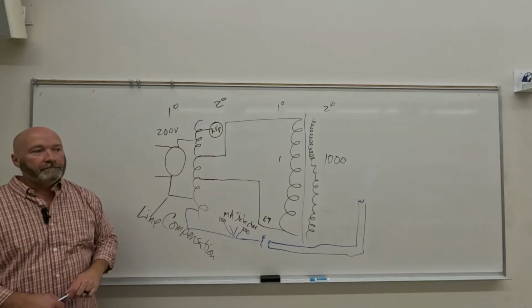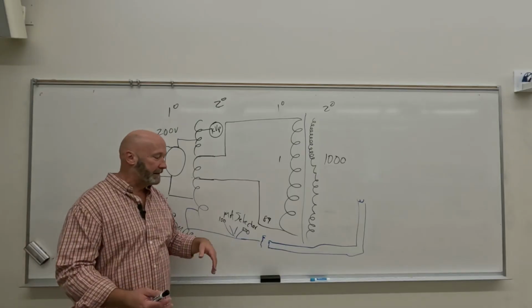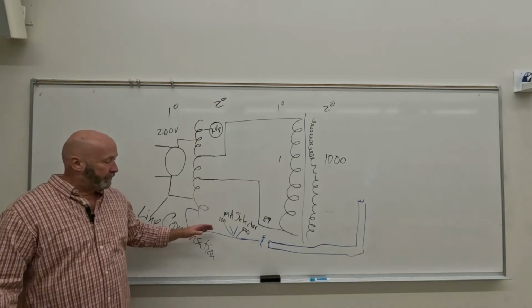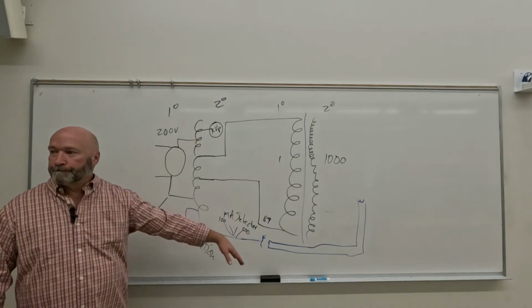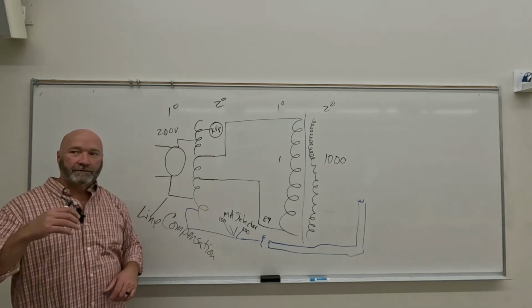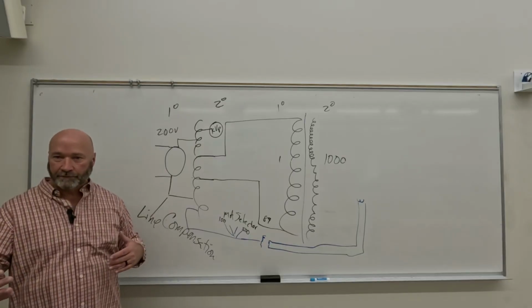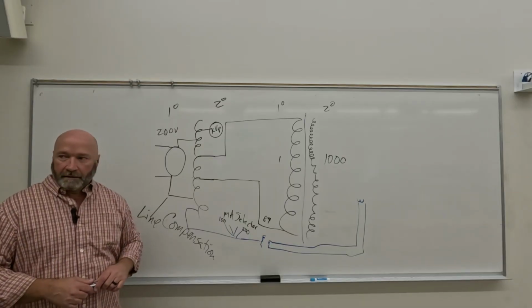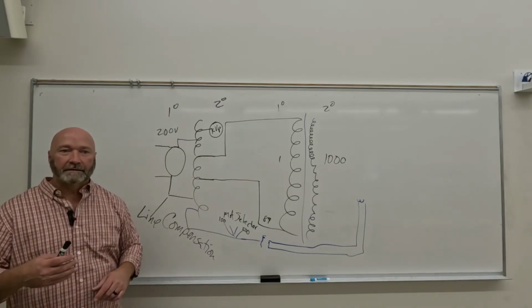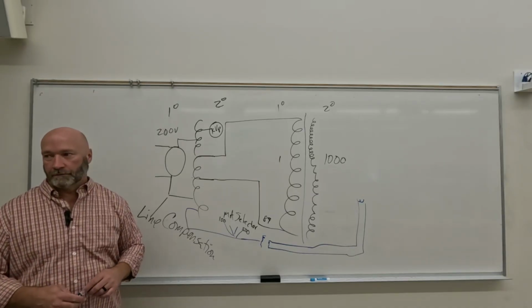the tube. Now, if you're selecting a technique and the only thing that you move is your mA, it's going to be big moves, right? From 100 to 200, 300 to 500, it's going to be big moves. But you can change your mA and change your time to arrive at the same mAs at exposure. Okay? So we can manipulate that. So what are the characteristics that we want in an exposure? What are the ways we control motion? We have 2 types of motion.